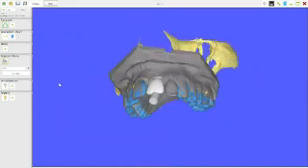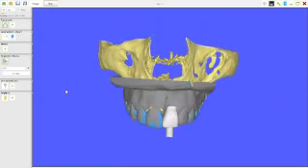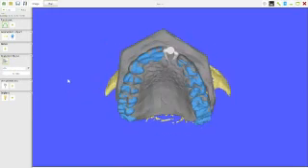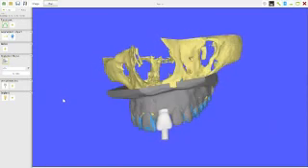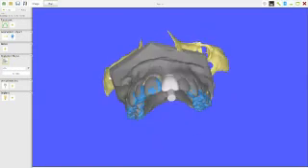Now all we've got to decide is, are we going to accept that, or are we going to be happy with the thing popping through the nose? Or do we want to go for a shorter one? If we want a shorter one, we could drop it back down to 12 if we wanted.